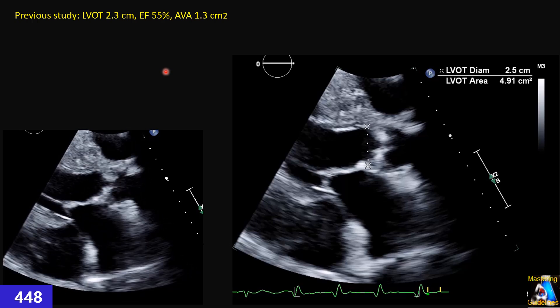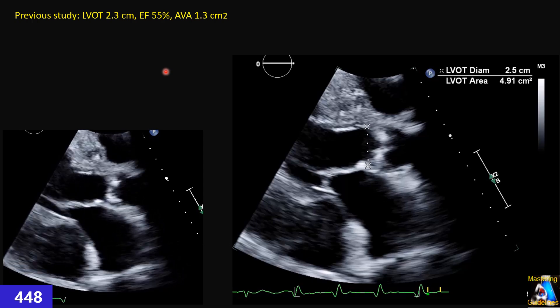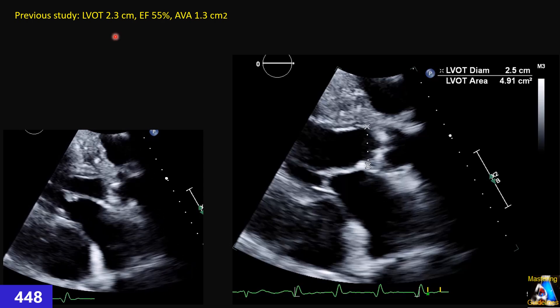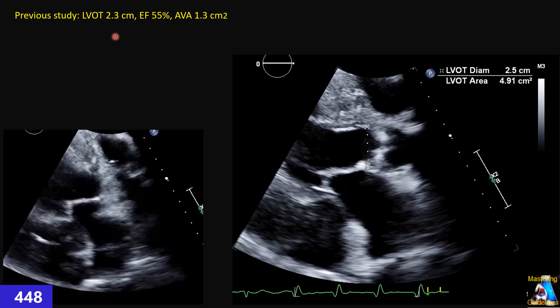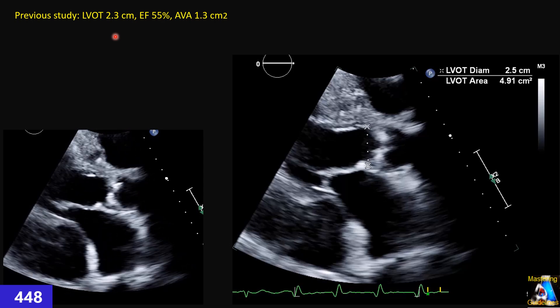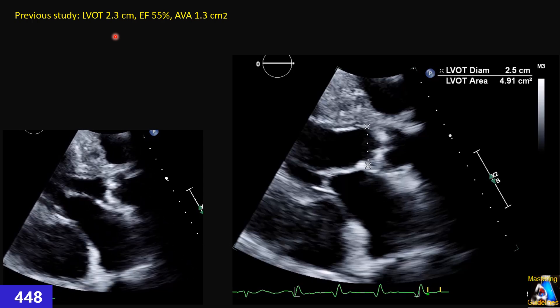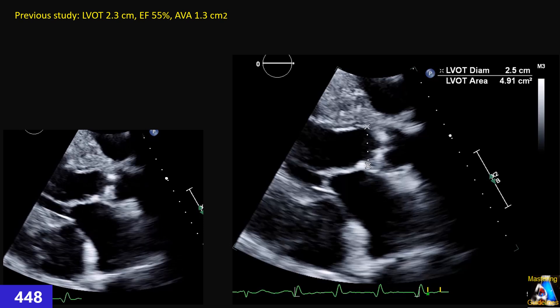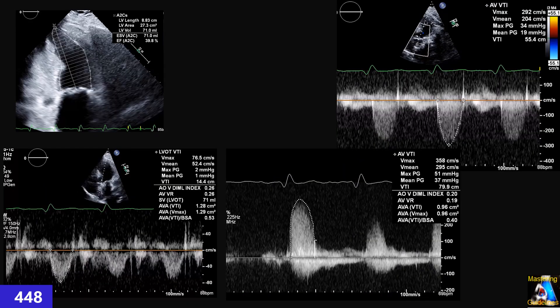Can any situation change the size of the LVOT? In this patient, the ejection fraction measures around 38% — roughly 35 to 40%. So what are the rules, which value do we use, and how do we make the decision? We measure other parameters, including EF around 39%. Then we do Doppler on the aorta. In many cases, especially with low ejection fraction, we have beat-to-beat variance. Do we average them, measure all of them — at least 3 or 5?